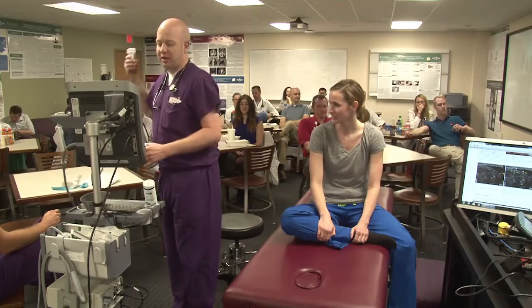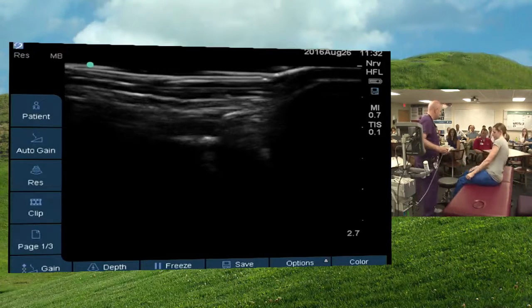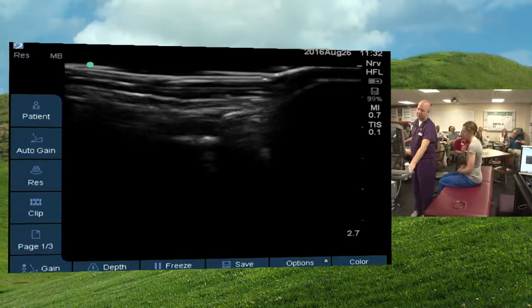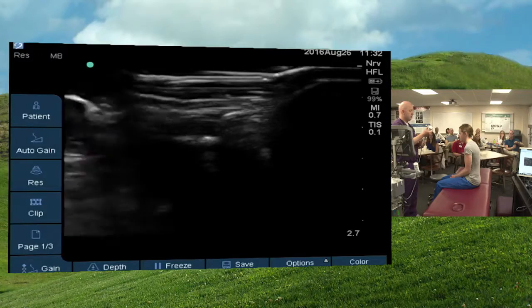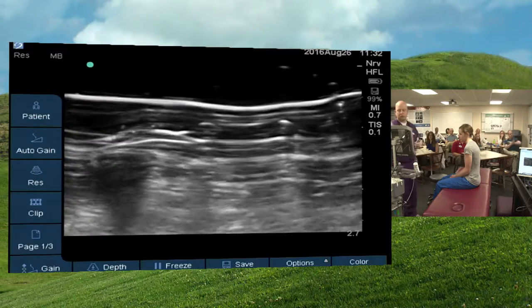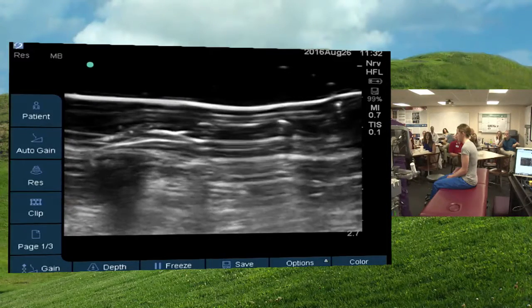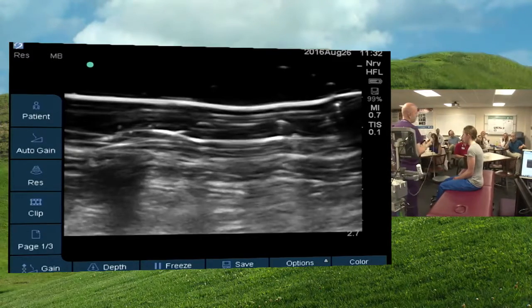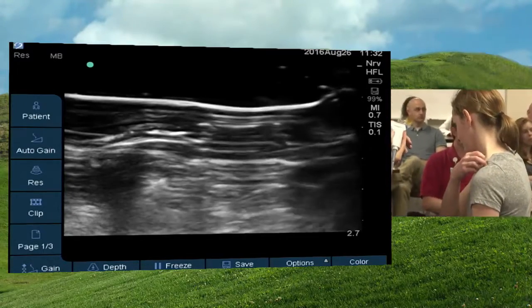But if you remember the brachial plexus, and it's never a fun thing to remember, or pull out your Netter again, there's a lot of great anatomy there, and so you can do selective nerve blocks. If you remember what part of the hand is innervated by which nerve, you can go ahead and do those. This is very specific to anesthesia, kind of an introduction to what nerve blocks we like to do. So starting at the top of the neck, you're all sorts of gooped up, figuring out what side is lateral and medial.